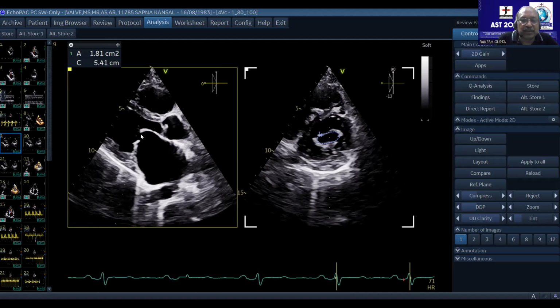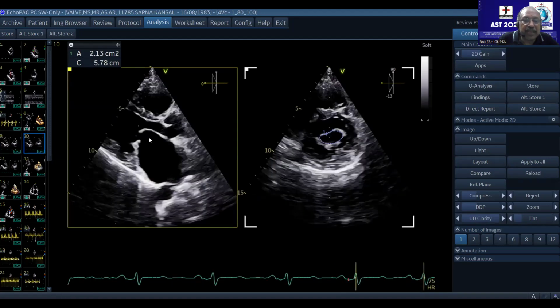What exactly is it trying to do? You can see a view where it's cutting at the tip of the mitral valve leaflet. This is not cutting correctly, but this leaflet is off and this is right cutting at the PML level. So this PML is very comfortable, but we are not comfortable with the AML level. It has to cut at this level. So we went on to the next frame and now it's trying to cut at the same level.